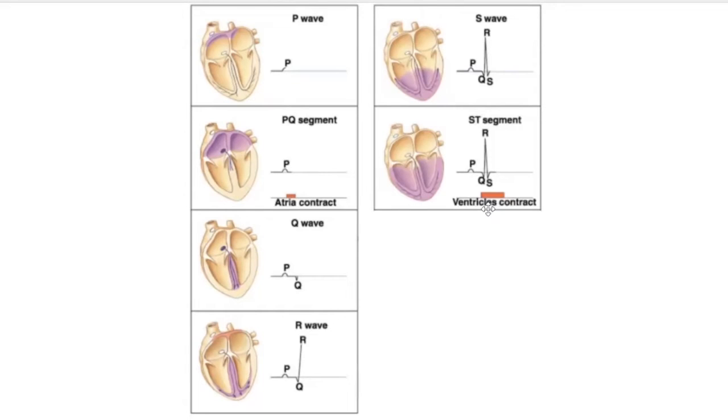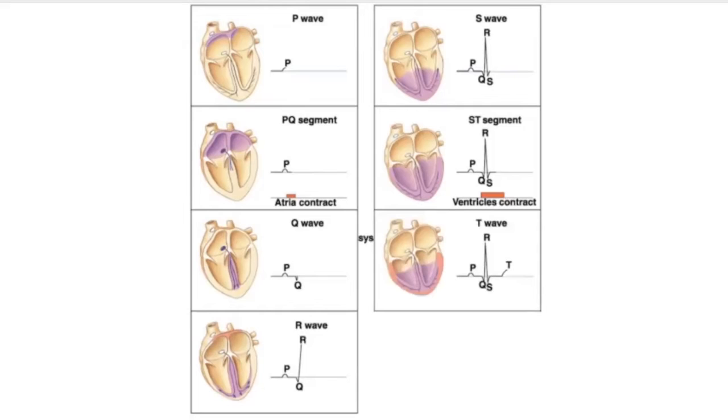And they have a characteristic shape, which involves the electrical potential of the cell going up and down, right? So in this case, as the heart cells all activate, their electrical potentials go up, but then eventually they have to come back down to normal. And the phenomenon of all the cells in the heart coming back down to normal gives rise to another electrical wave. It's not quite a wave, it's more like a thing that happens about the same time throughout the heart. It doesn't propagate from cell to cell quite the same. But that gives rise to another characteristic wave on the ECG, which is the T wave.